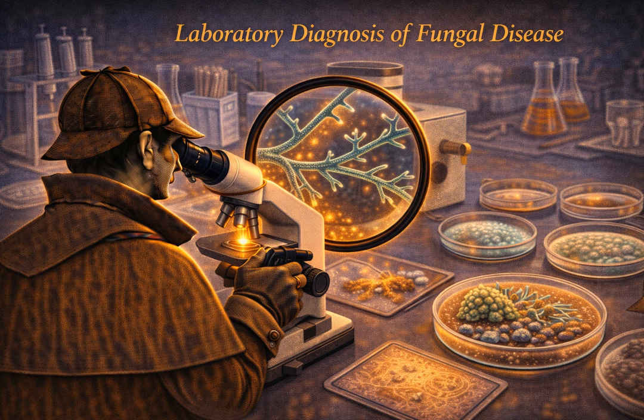How long does that take compared to old school methods? The run itself takes minutes. Compared to setting up biochemical sugar assimilation tests that take days to turn color, it is an absolute revolution in turnaround time. Does it work for everything? Molds and yeasts? It is amazing for yeasts. Candida, Cryptococcus. It has completely changed how we handle yeast identification.